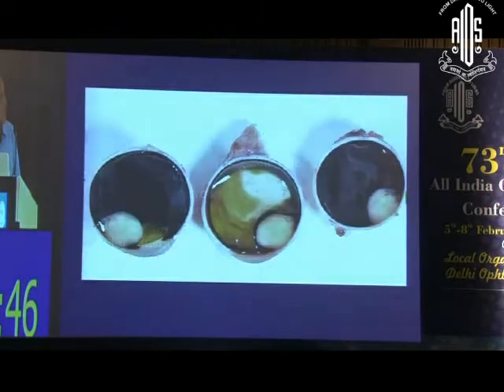Okay, now what do you think this is? This is a cut section of an eyeball. You have the optic nerve over here. That's the cornea. So what would this region be? Is it choroid? It's a ciliary body region. Now what type of mass do you see over here? It's a dome-shaped or round solid mass. Pigmented, non-pigmented? It's a non-pigmented mass.